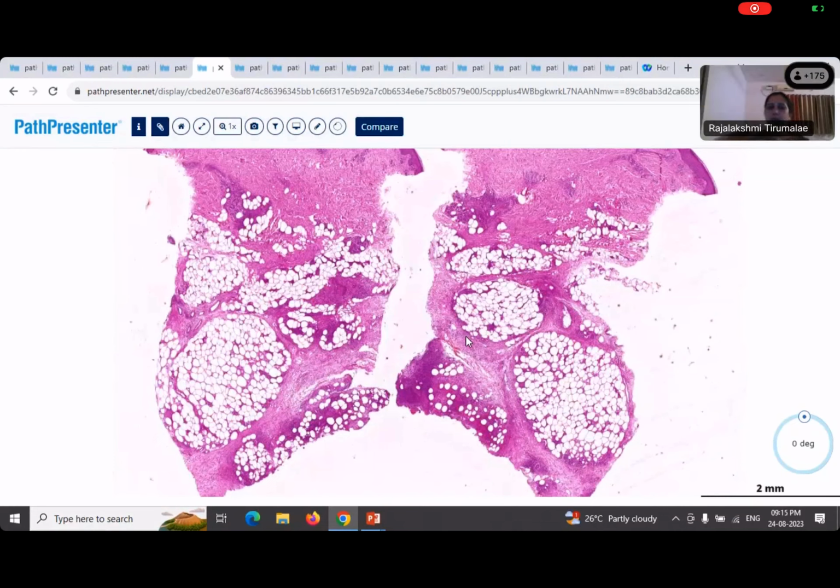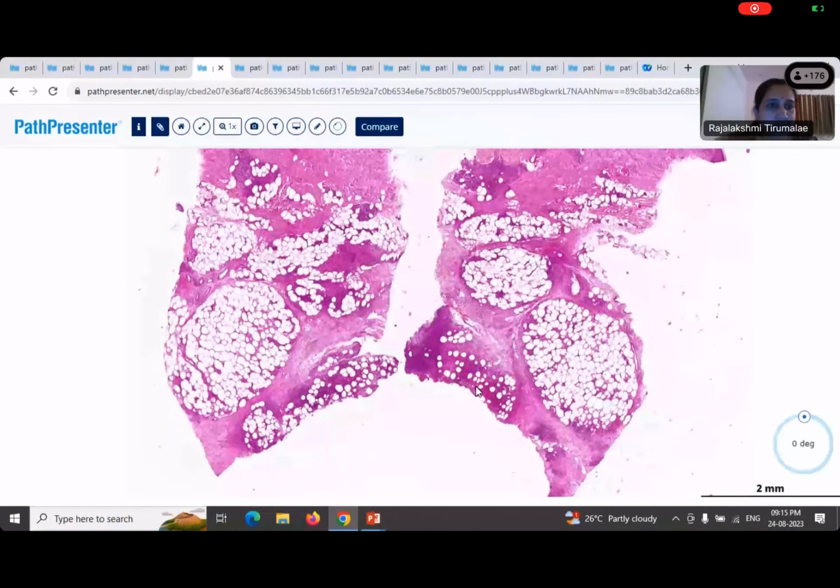So why do we use this word predominantly? Why don't we say just septal and lobular? See, this is not a watertight compartment, right? Even erythema nodosum, a so-called classical septal panniculitis, can have lobular involvement sometimes. And what is typically described under lobular panniculitis can also show septal changes. The textbooks don't read, it's we who make up the books and the criteria, so there's quite a bit of overlap. What you're seeing here is a predominantly septal panniculitis.